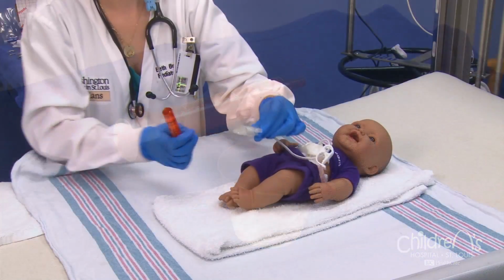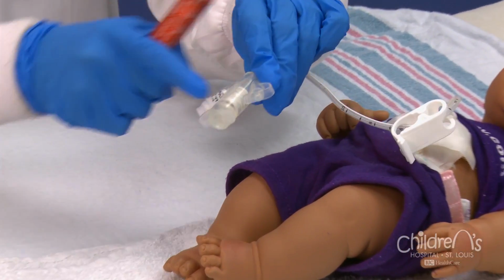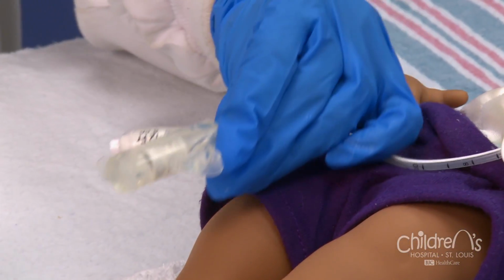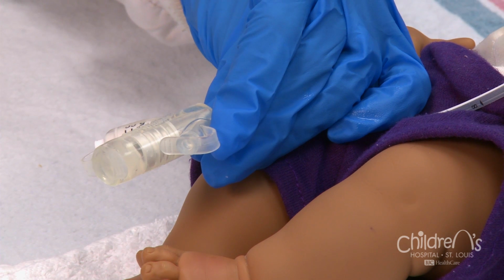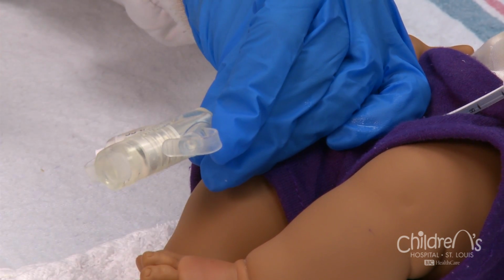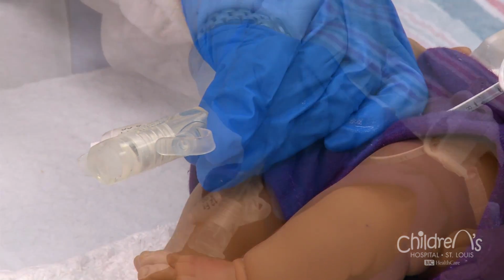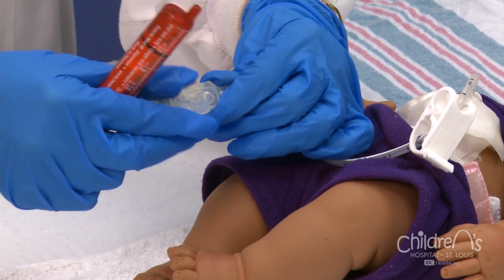Your child's tubing may have a medication port. This is a smaller opening in addition to the one used for feedings. If your child has this second port, you must make sure the feeding port is closed when using the smaller medication port. To administer medications through the G-tube, follow these steps.